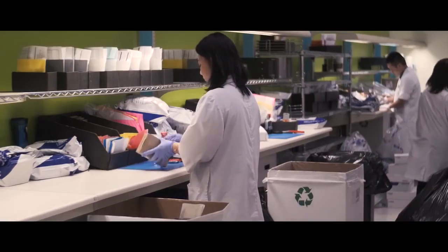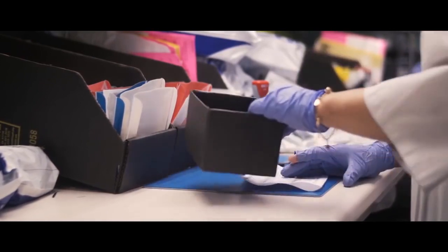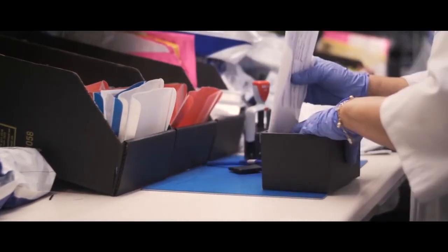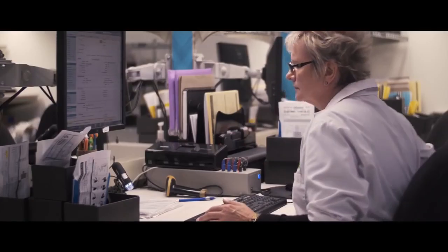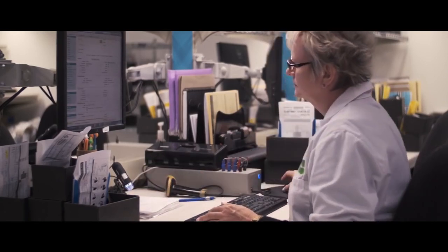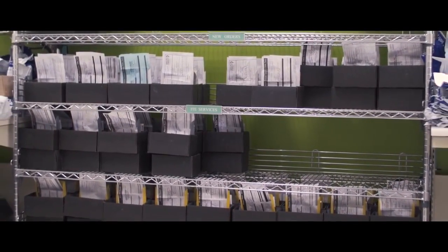My name is Irene. I have worked at Phonak in order entry for almost 14 years. The production of hearing aids starts with us. When customers send us orders, we check the paperwork and special instructions to enter the order into the system. We also enter audiograms. This step allows us to pre-program the device before the hearing aid leaves our facility. We have to know which options are available and compatible with our products. I love this job. I love doing my job. And when I read customers' notes, I can see that we help a lot of people.